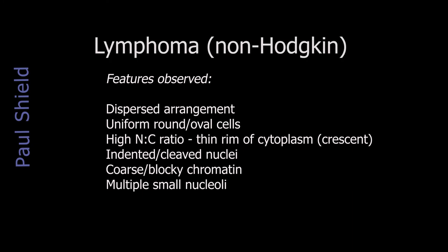We would undertake flow cytometry on the needle washout to try and confirm that, or to rule out a reactive lymph node. And we could do immunostains, but flow would probably be the best thing to do initially on this. If we were to do immunostains, then certainly CD45 would be in the panel to try and identify lymphoid cells.